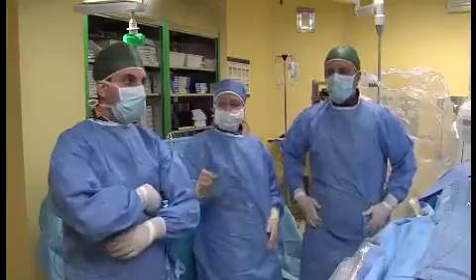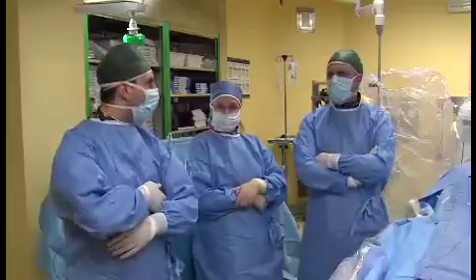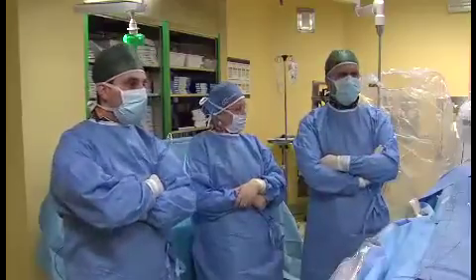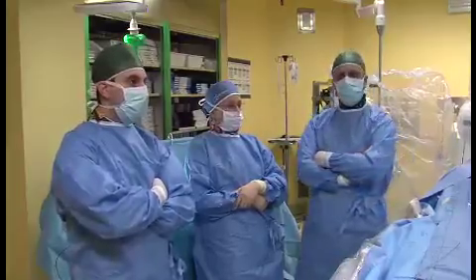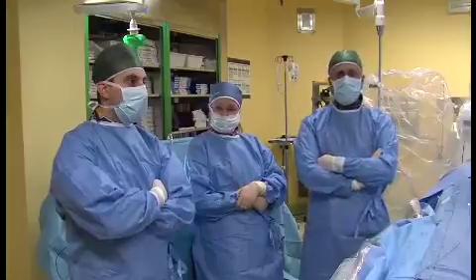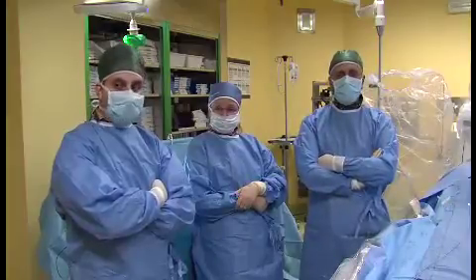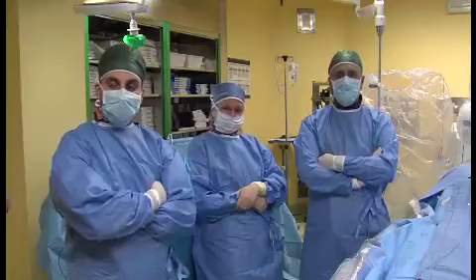I think the likelihood is that, because of one technical problem with a pre-stented and even flared left pulmonary artery stent that was sticking into the origin, the cone would not go around the bend. And so if there is significant stenosis, I think probably the best way would be to implant the venous valve, wait for about 6 months or so, and then deal with the branch pulmonary artery stent.